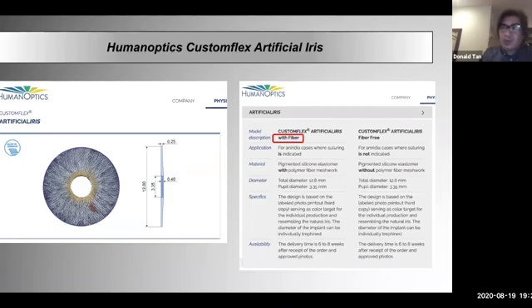And the fiber version is the one to use. If you are going to insert this in the bag and you're not going to use sutures, you get a fiber-free one. Now, my experience with this has been all with the fiber version. You can use a fiber version even in the bag placement, as I'll show you. So you have to be careful that you understand which one you need to order.